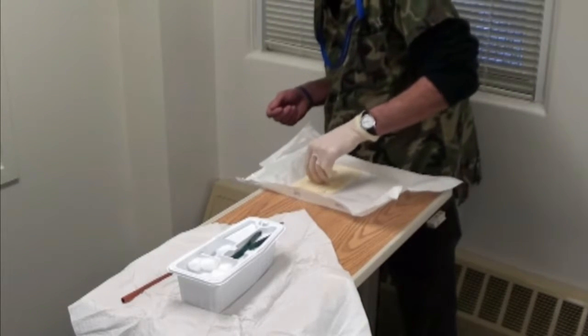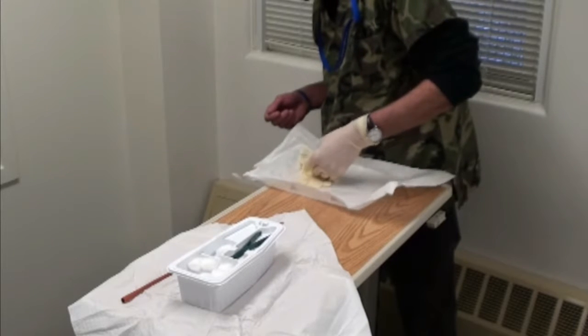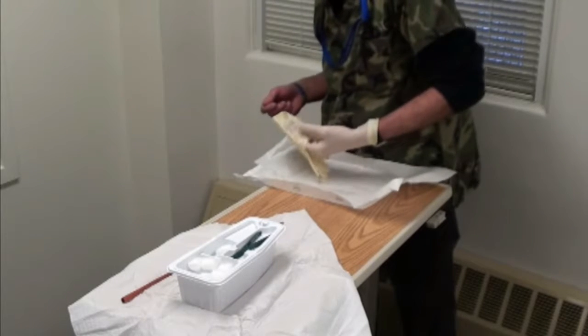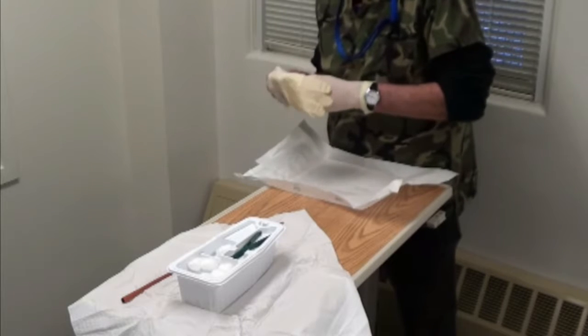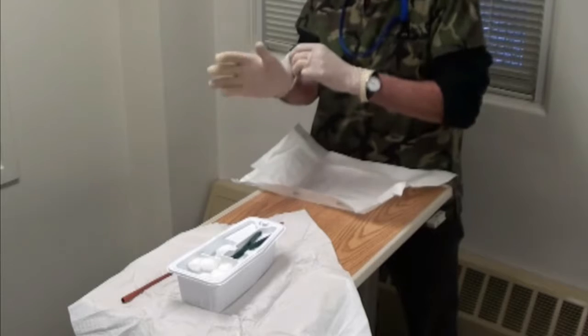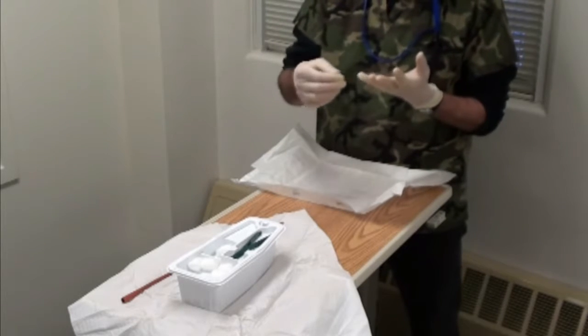Cuffing under, I'm going to pick up a right glove, inserting three fingers at least in. Okay.